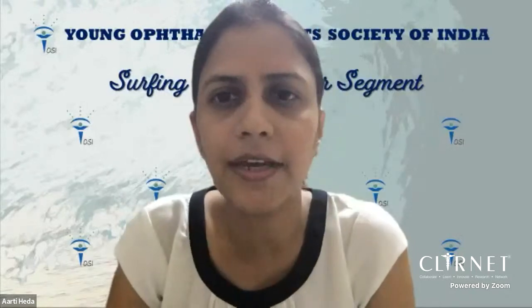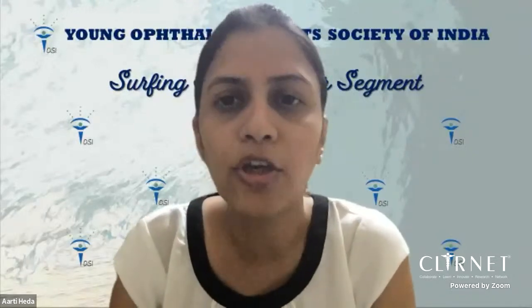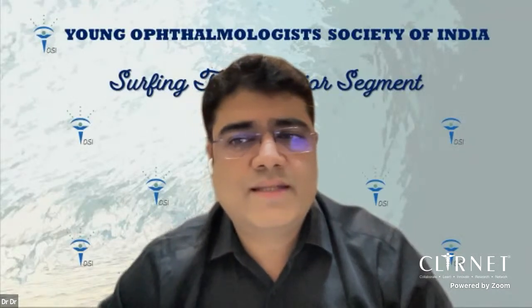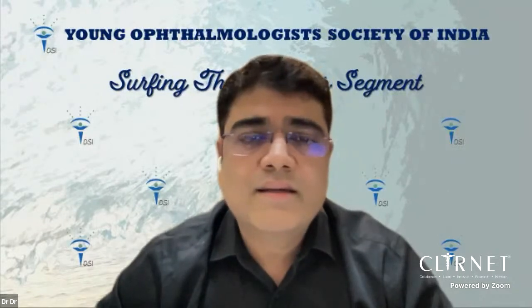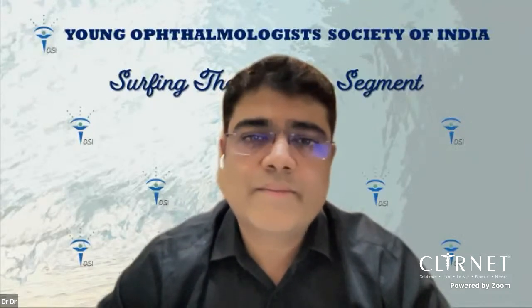So if we are doing a case under topical anesthesia and pre-operatively there are no risk factors and we don't expect anything to happen intraoperatively, but it happens, how would you suggest we supplement the anesthesia? You can give subtenon anesthesia. That's a very good way, which gives adequate anesthesia for even pars plana vitrectomy to be completed under subtenon. I personally don't do pars plana, but my VR surgeon does it under subtenon, and a lot of surgeons are doing it.